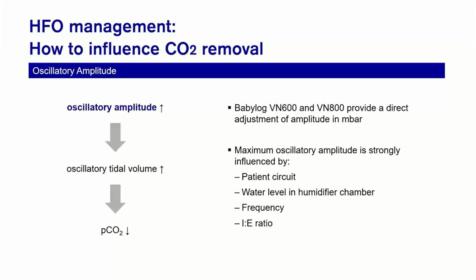However, factors like frequency or I:E ratio are also important to the maximum achievable oscillatory amplitude, because it's simply the fact that a lower frequency and a longer inspiratory time in total will give the ventilator more time to build up pressure.